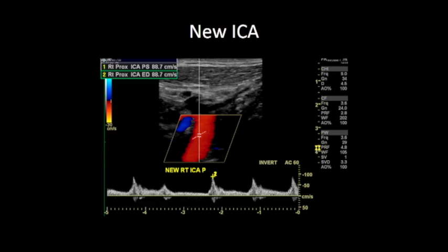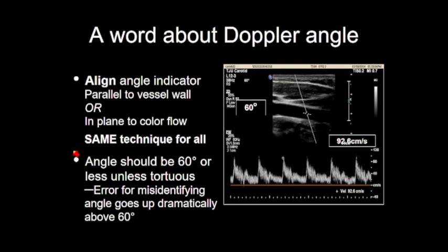Yes. So I mentioned it when we talked about the first set of images, but that was a little bit too much for her to handle. So she was able to get the IC-EC part. So we have to save that conversation about angles a little bit, right? So let's have a word about angles as we do this, right?